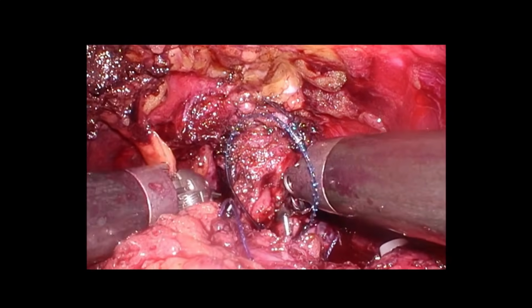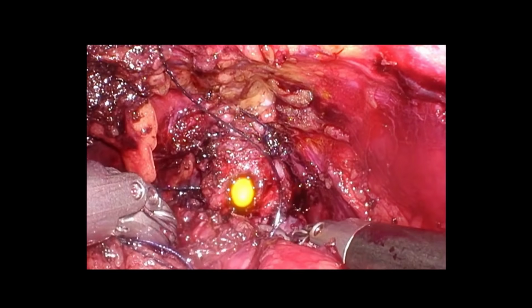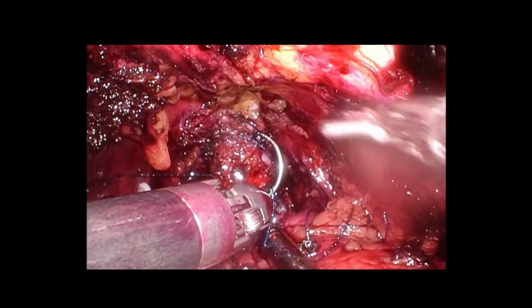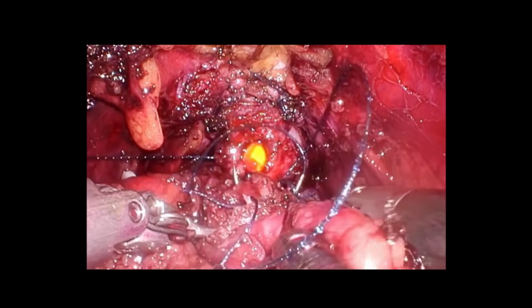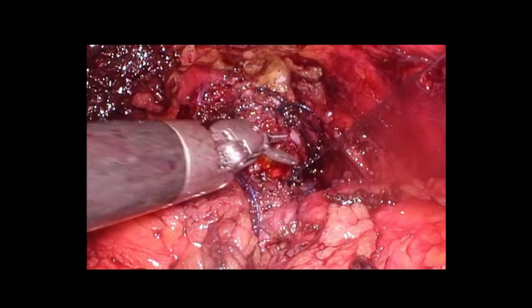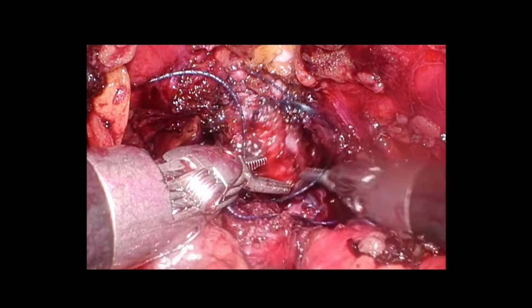We are taking the 7 o'clock position first with 3-0 V-Loc. Following that, another suture is taken to put the 6 o'clock to 5, as well as on the right side of the anastomosis. This symmetrical pulling of the two sutures on either side gives a good mucosa to mucosa approximation and a leak-proof urethrovesical anastomosis.